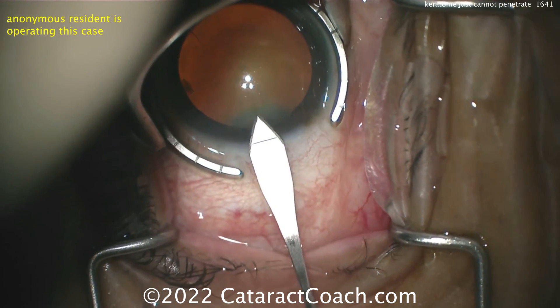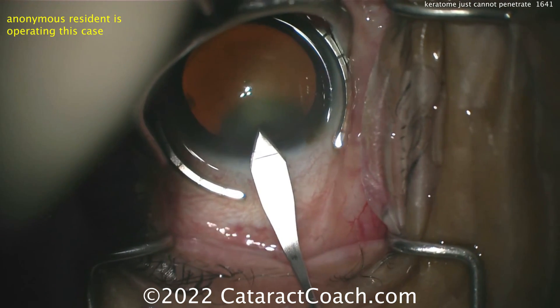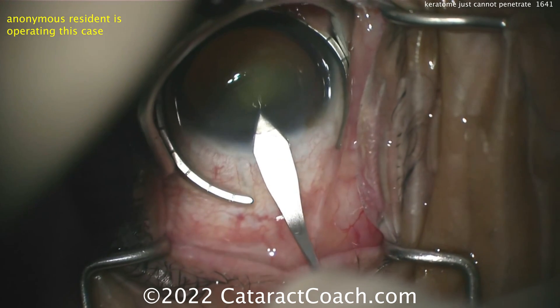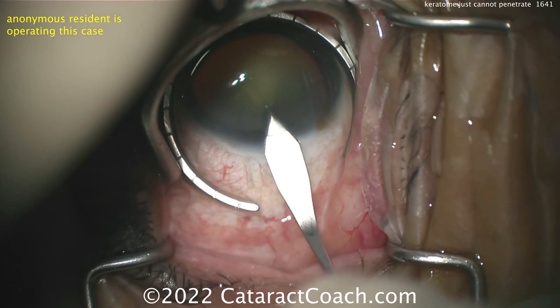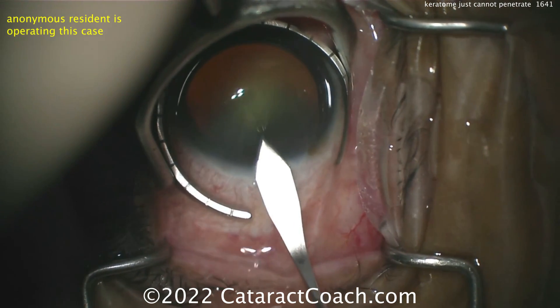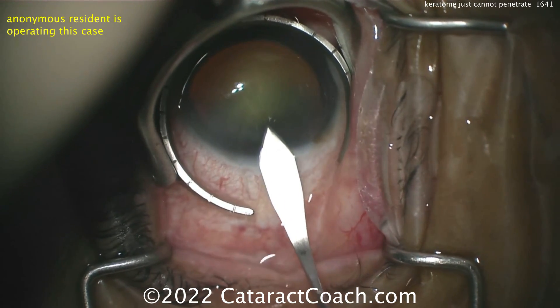I like that. Let's look at that tip — when does this tip penetrate Descemet's? Let's see. No luck. Look at the eye slipping away. The fixation ring is unable to hold the eye. The ring is touching the corneal epithelium. Unable to enter. Now, is the issue there the technique, or is the issue here actually something else?